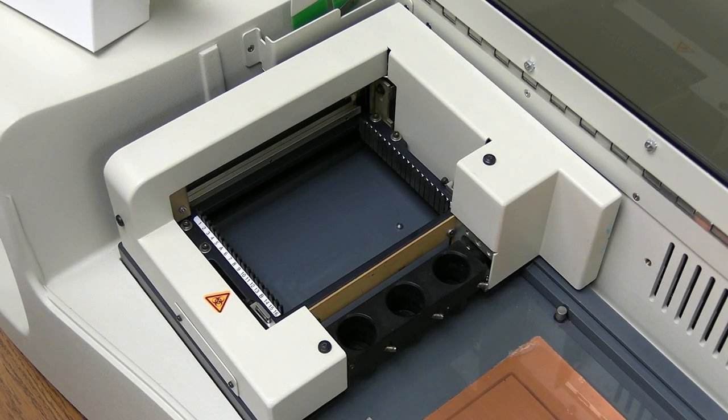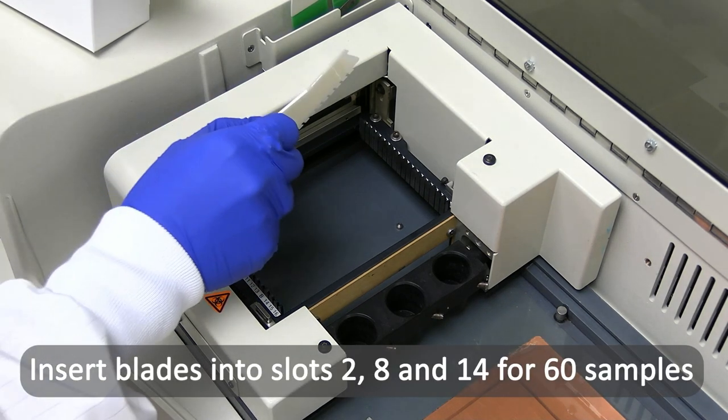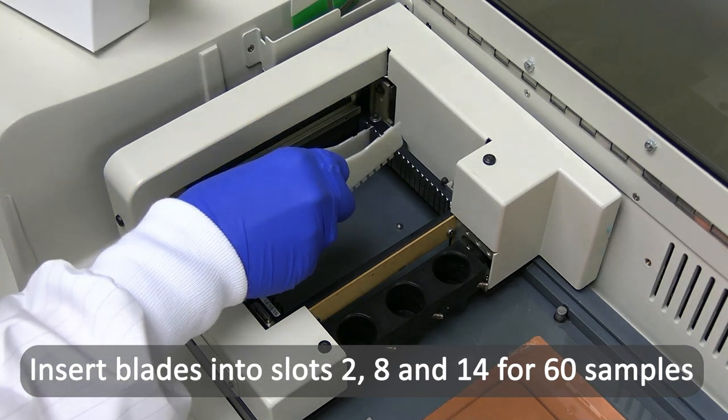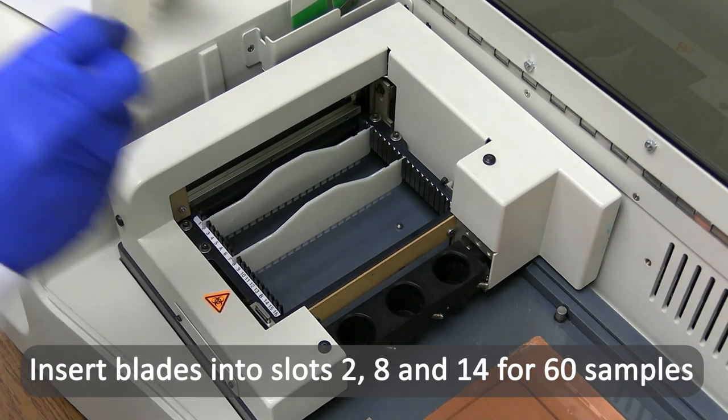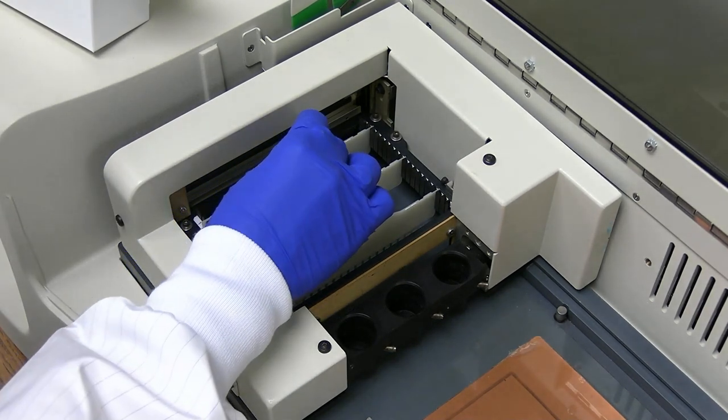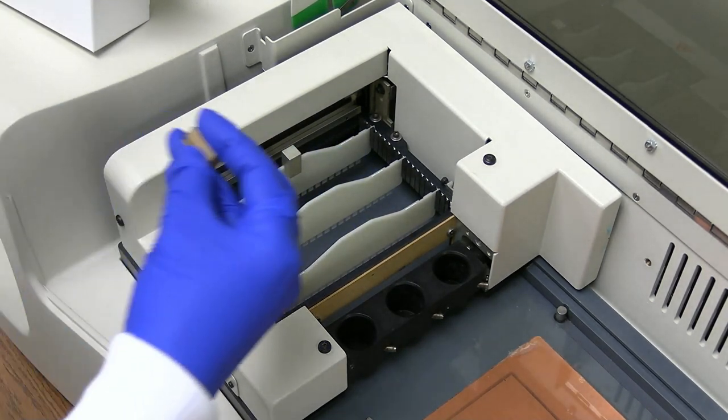For 20, 40, or 60 samples per gel, insert a maximum of 3 applicator blades into the vertical slots marked 2, 8, and 14 within the applicator assembly. Add an applicator blade weight to each blade with the thicker side oriented to the right.